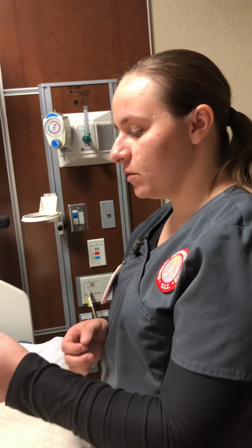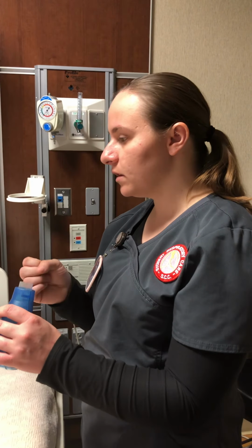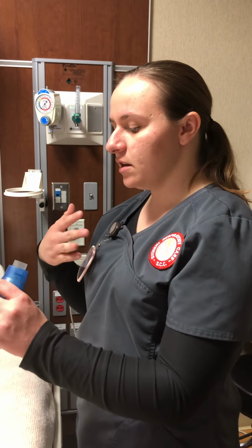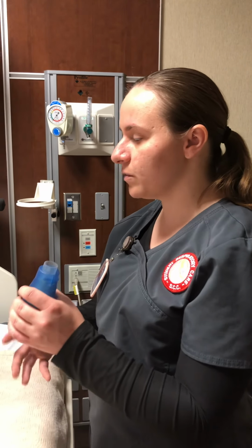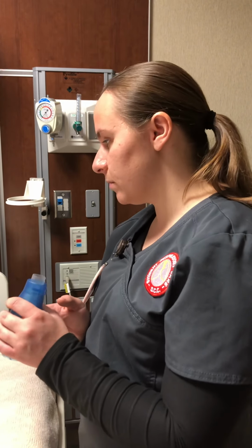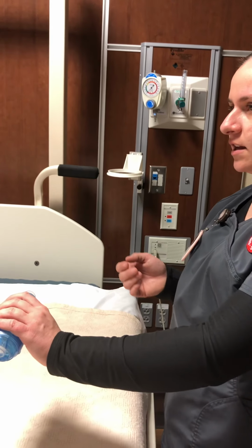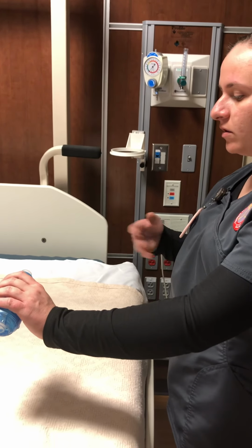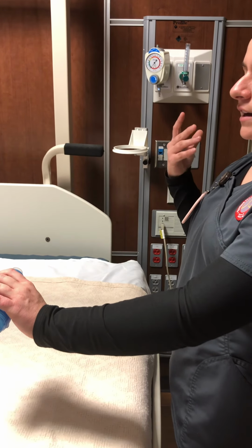So let's go ahead and we'll practice. I want you to breathe through your mouth, not through your nose. So we're going to take a deep breath in and exhale. I want a strong exhale, but we don't want to do it forcefully to where the machine won't work properly. Alright, so I'm going to put this here with you. I'll have you hold it, and I'll take a deep breath with you, and we'll exhale, okay? Ready? And exhale.